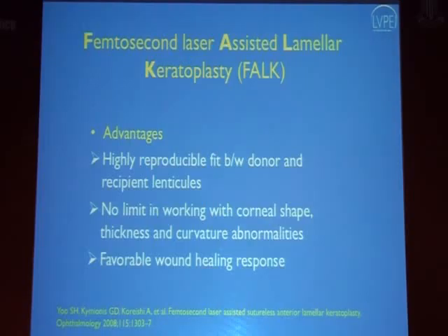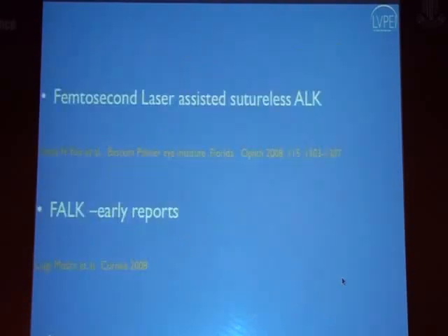So with that, I would like to discuss another technique, which is femtosecond laser-assisted lamellar keratoplasty, or FALK. As Dr. Alavi had highlighted, the advantages of this technique are a highly reproducible fit between the donor and the recipient. In fact, the best fit that you can get. There's no limit in what kind of shape you would like to create, as you mentioned, and in the curvatures that you would like to obtain. And then you have an extremely favorable wound healing response, so you can do this as a sutureless technique.